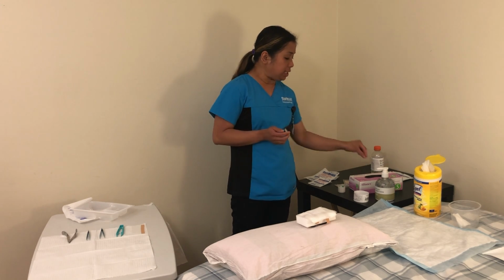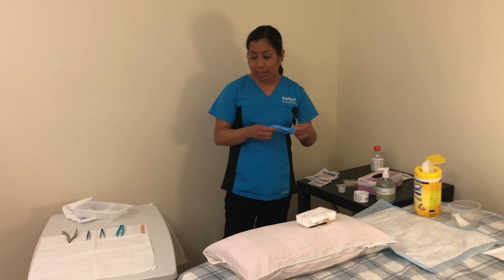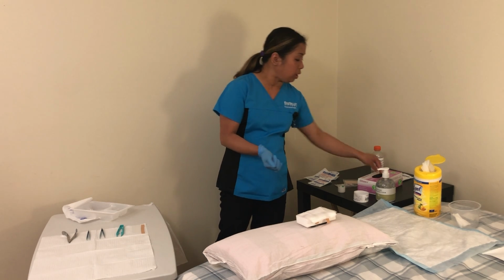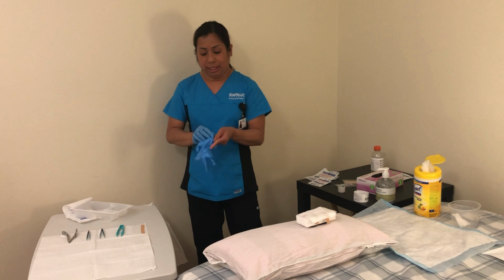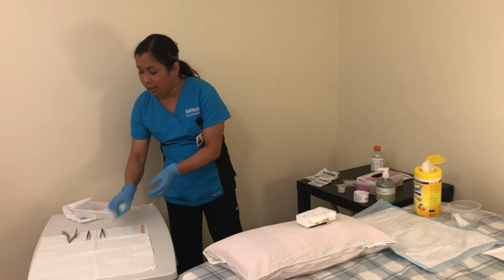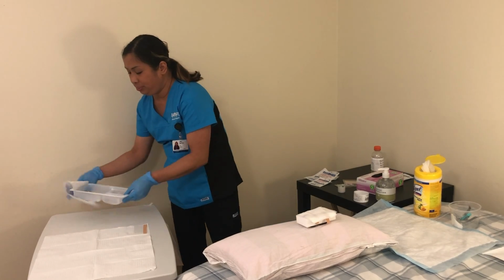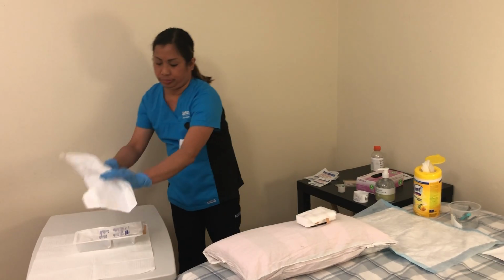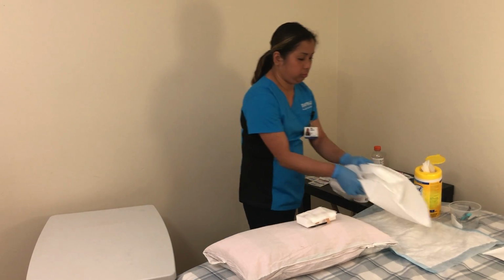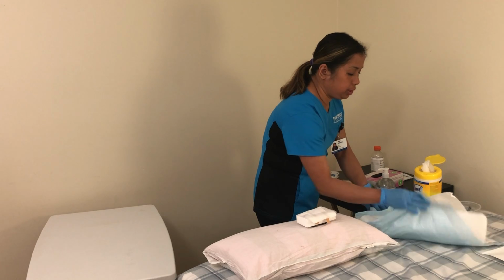What I do next is sanitize my hands and discard all my materials. The sharp objects go in the sharp container, and the rest goes in the biohazard garbage. I will remove everything here.